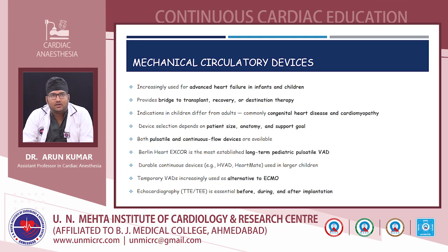The next topic we'll be seeing is mechanical circulatory devices. Nowadays they are increasingly used for advanced cardiac failure in infants and children. Mechanical circulatory devices provide a bridge to transplant, recovery, or destination therapy. Indications in children actually differ from adults. It is most commonly used in congenital heart diseases and cardiomyopathy in children. Device selection depends on the patient size, anatomy, and the indication. Both pulsatile and continuous flow devices are available.